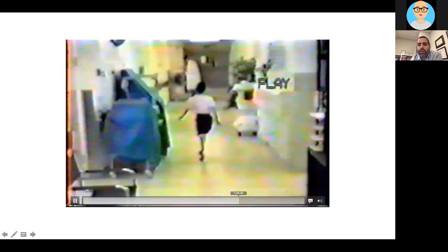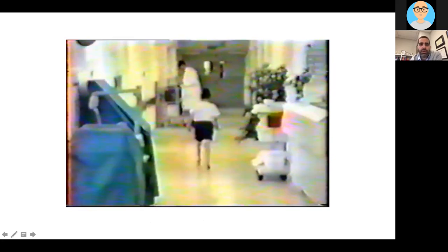So deep brain stimulation was proposed, and the part of the brain that was targeted is known as the globus pallidus. And then several months after the procedure, this was him. Okay, this was him able to walk. So again, we are stimulating here a part of the brain that is less than a centimeter. Okay, so a very small part of the brain. You can see profound effects on every aspect of his motor life. And this underscores the fact that a condition as complex as DYT1 dystonia just requires resetting activity in a small part of the brain. You can see the entire circuit being ameliorated, essentially.